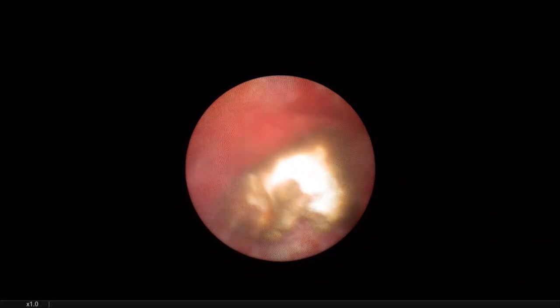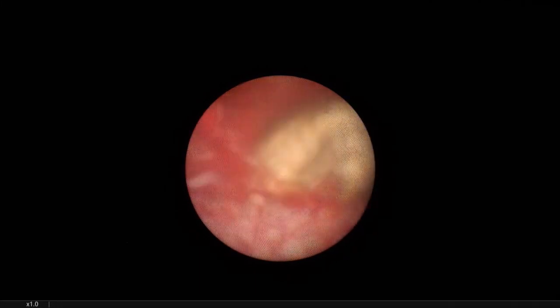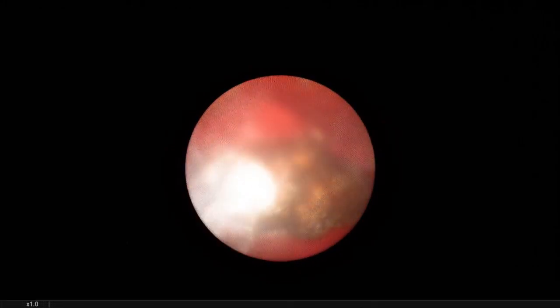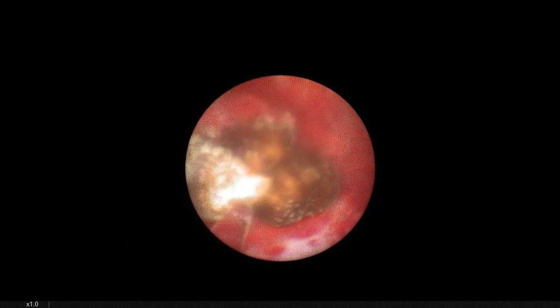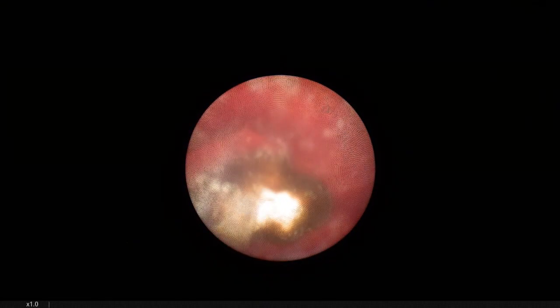This is a good laser setting, I think. I think this level of energy is enough. Yeah, it's okay. This is a topic we had yesterday evening. Is it really recommended to have a high power laser in stone surgery? And my opinion is no, it is not.